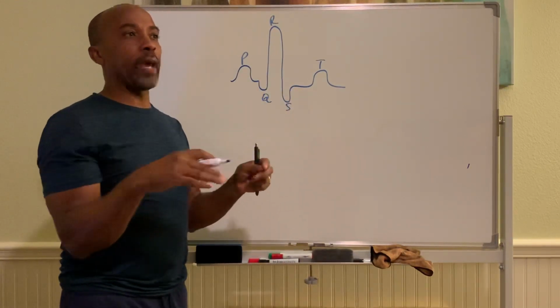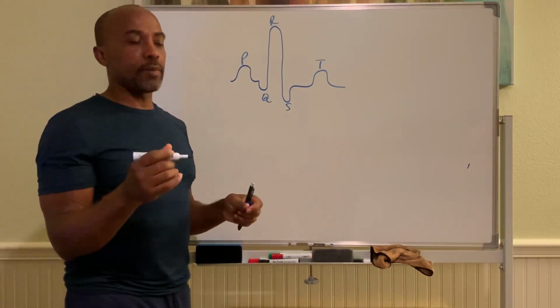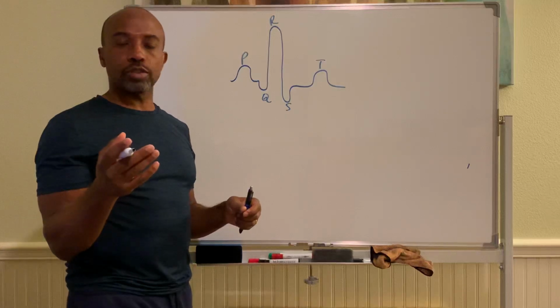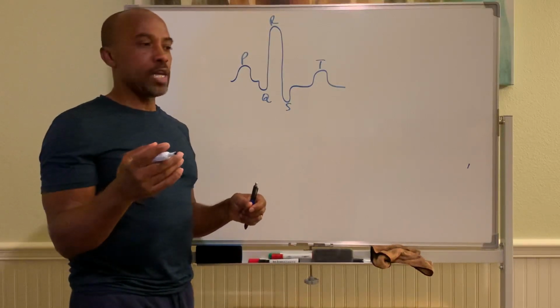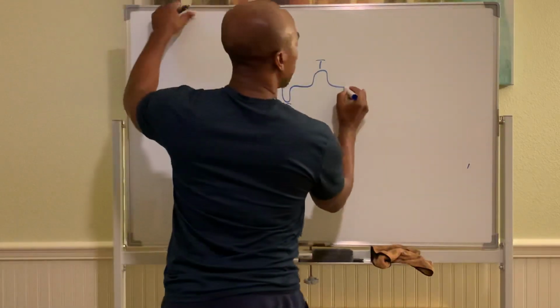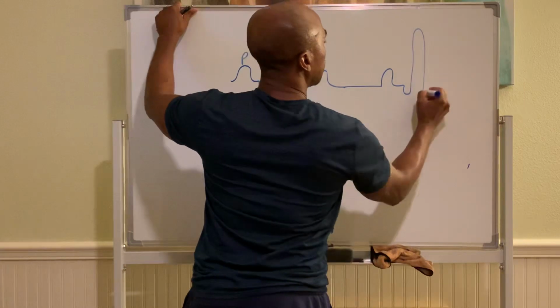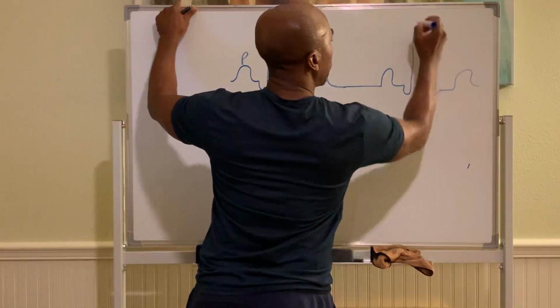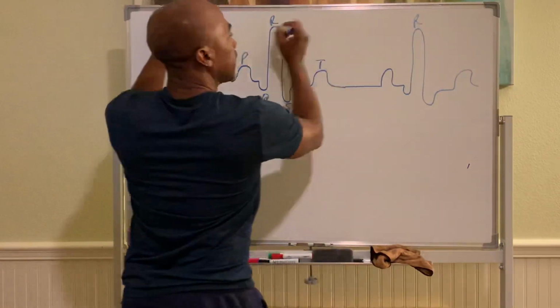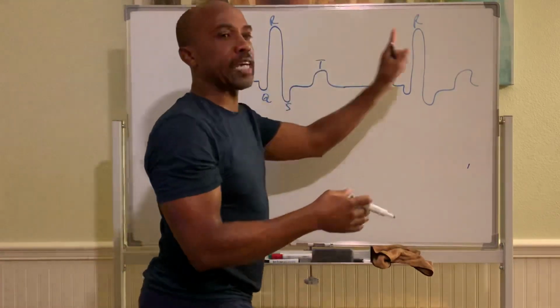And then we ask you to analyze them for a few things, okay? So there's something called the 5 cardinal rules of EKG, where the rhythm has to be regular, meaning from R to R. That's the time from one R to the next R should be the same consecutively.